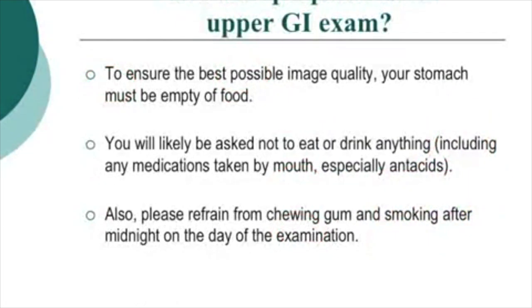You may wonder how best to prepare for this test. To ensure the best possible image quality, your stomach must be empty of food. You will likely be asked not to eat or drink anything, including any medications taken by mouth, especially antacids. Also, please refrain from chewing gum and smoking after midnight on the day of the examination.